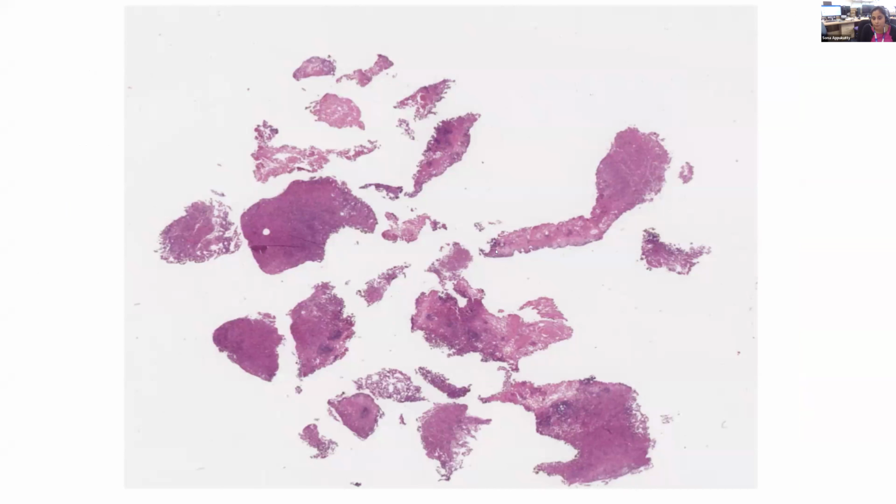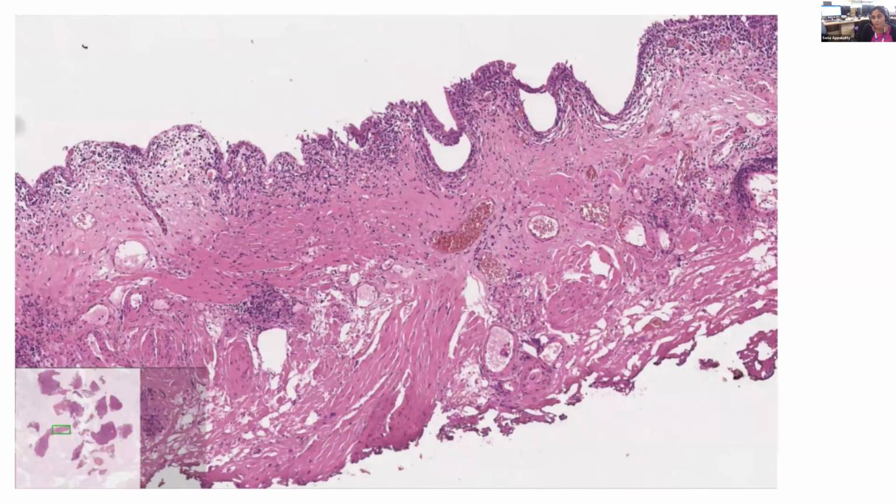Probably a small fragment where you have a loose connective tissue in the lamina propria, which normally it should be. Then we have some rounded bundles of muscle. Going closer to the normal area first, largely denuded surface urothelium, and where present, it appears non-dysplastic.